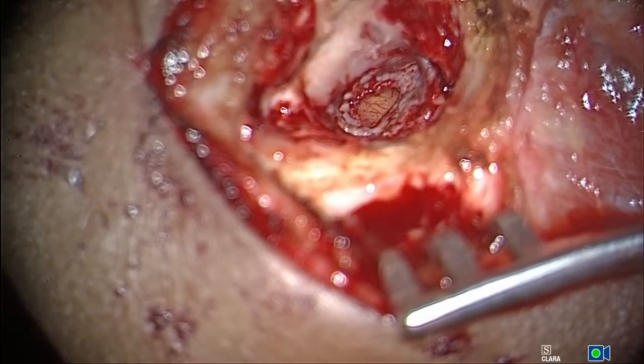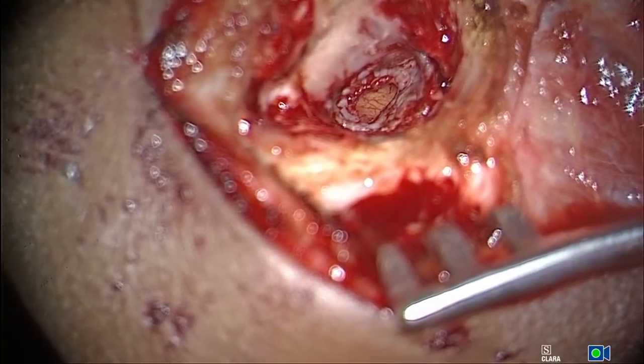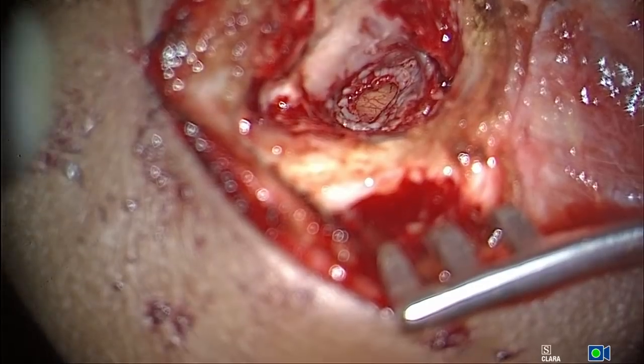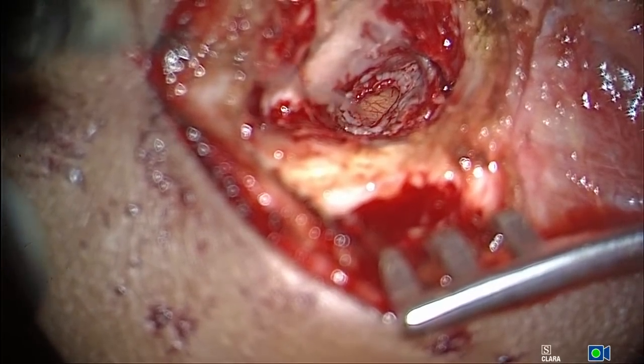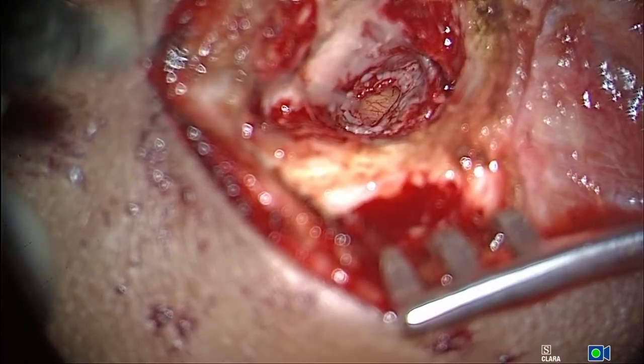Why canaloplasty? You don't need a canaloplasty. Canaloplasty is just to see all the edges of the perforation. Elevator? Elevator.